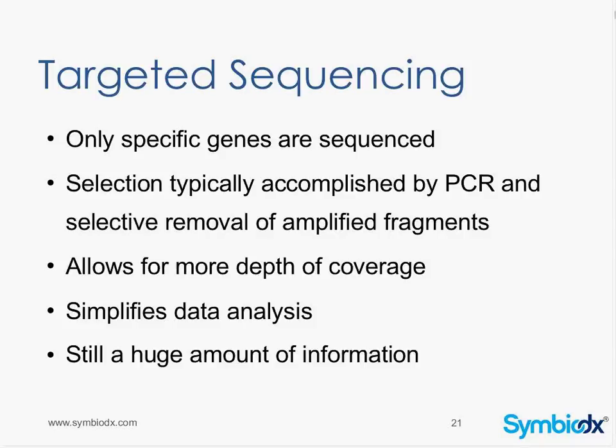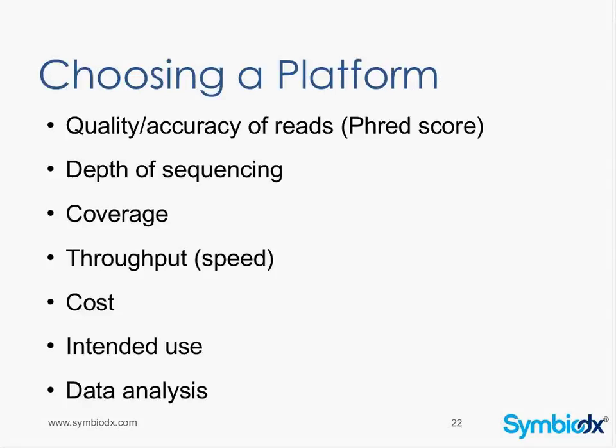Now we're looking at 68 genes on our assay, which adds up to a total of 700 amplicons. And we're looking at them in depth. So we can see minor clones, we can see heterogeneity, we can see lots of different findings. So the amount of data that we're getting is still massive, even with targeted sequencing.